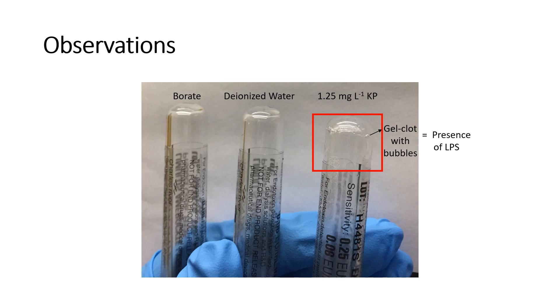As shown in this close-up picture, there was no gel clot with bubbles observed for borate buffer and deionized water. Thus, this indicates the absence of LPS and further confirms their identities as true negatives.